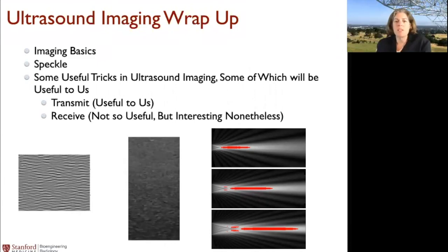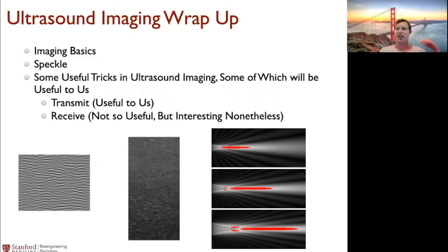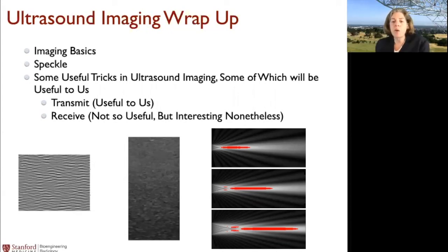It is cheap and easy. You compare an MRI system, which costs millions of dollars and is not portable. It's huge. It has very major siting constraints, to a very portable ultrasound system that sometimes is on a cart, which is relatively big, that moves around. But some of the newer systems are plugged into an iPhone and have a little transducer. Cheap and easy. Butterfly iQ, I think, right? Is that what it's called? That's right. Ultrasound is incredibly powerful for the size and the expense.